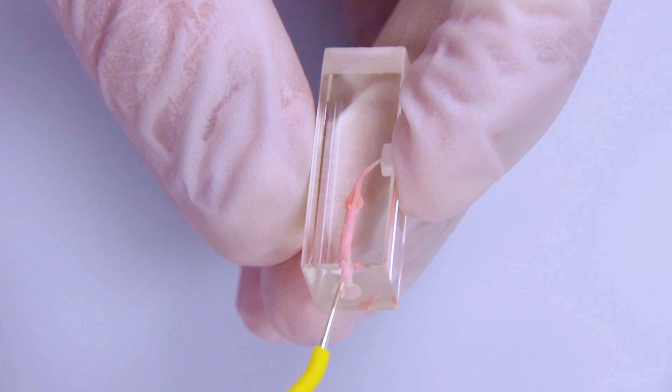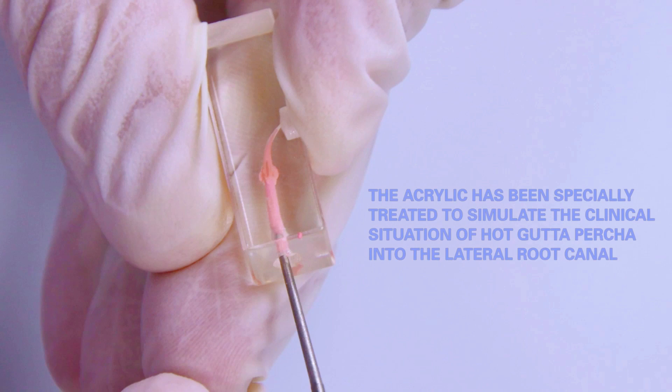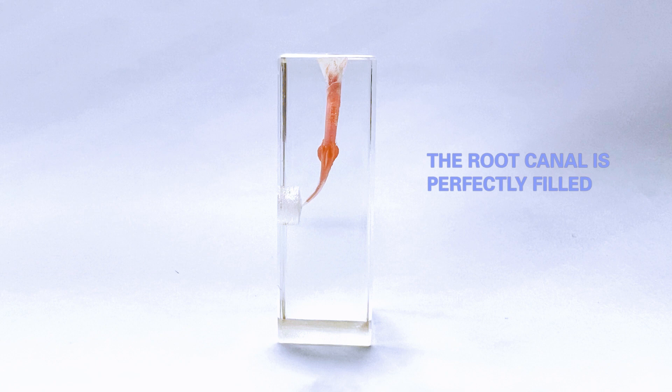The acrylic has been specially treated to simulate the clinical situation of hot gutta percha into the lateral root canal. The root canal is perfectly filled.